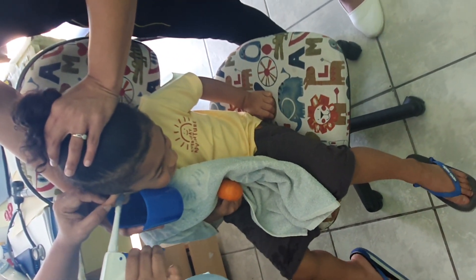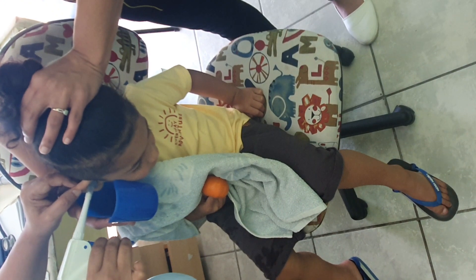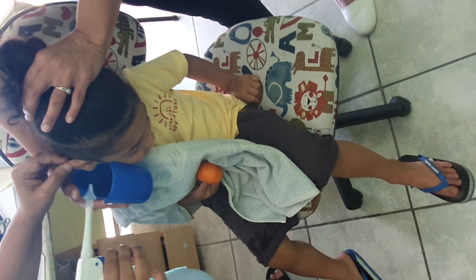I watched a video online where they put this head thing over — I think it's overseas — and it looks like a device that just rinses your ears out. Oh, lots of gadgets.